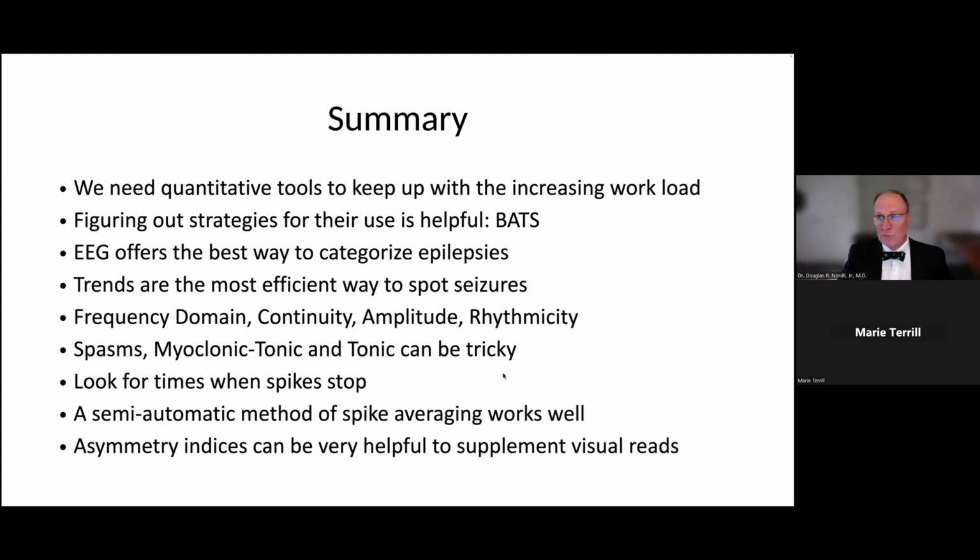So, I would still vote for a careful visual analysis. If you see something and you suspect something, check it out on the trends and see if it helps to verify your hypotheses. Okay, I am going to pause here and thank you for your attention up to now, and I'll turn over to questions.